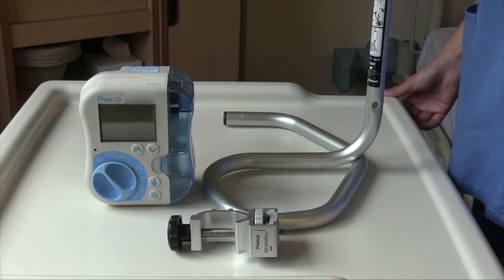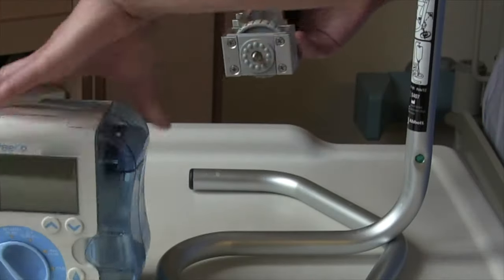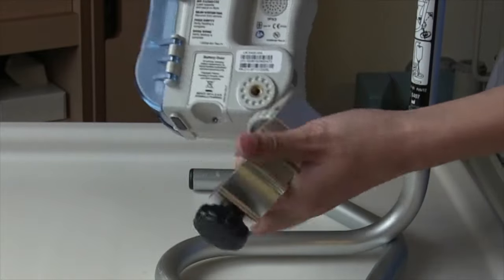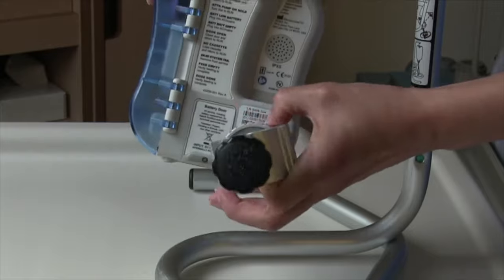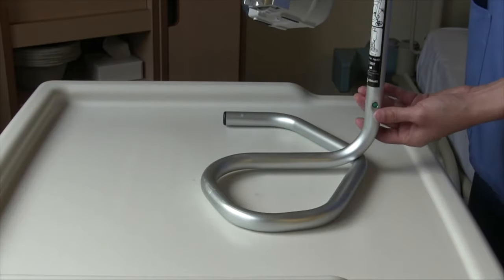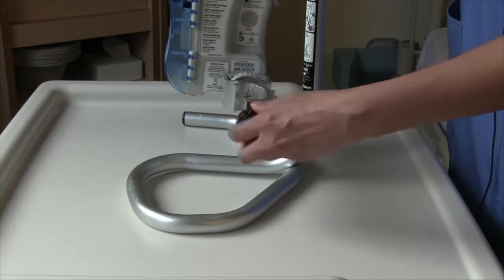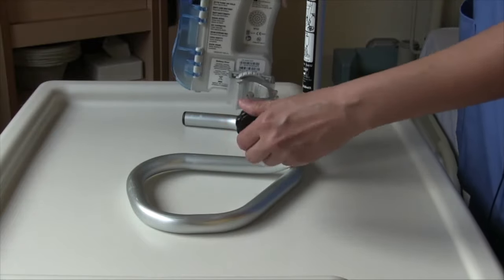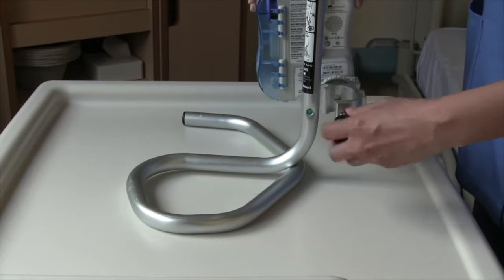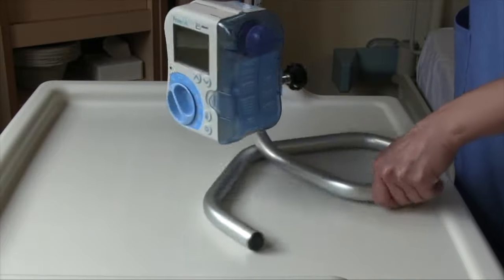Now we will go over how to set up the pole clamp to your machine and the stand. Take your pump and look at the back where there is a screw entry point. Connect your pole clamp to your machine by making sure it's horizontal and lining up the screw to the back of the pump. Then turn to tighten. Find the green dot at the bottom of your pole and line that up with this screw at the back. Loosen it so that the pole will fit inside the clamp, then tighten it, ensuring the pump is secured to the pole.